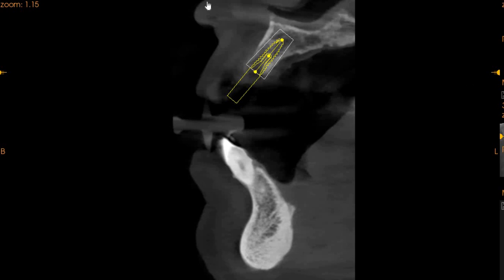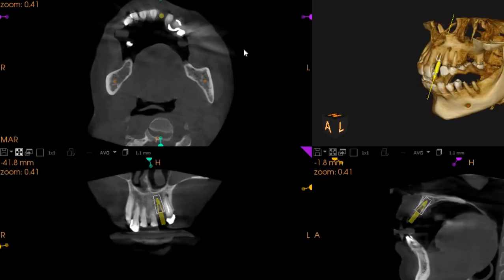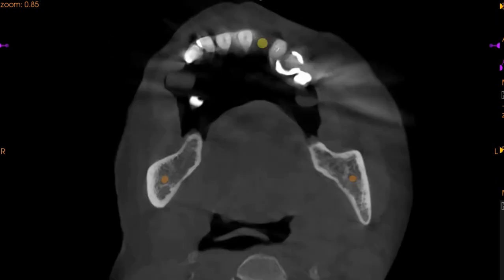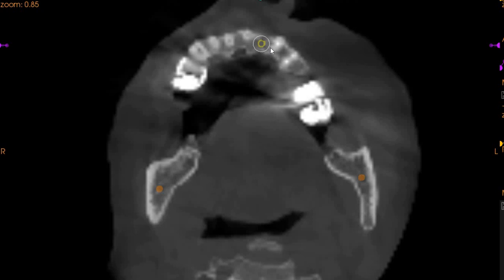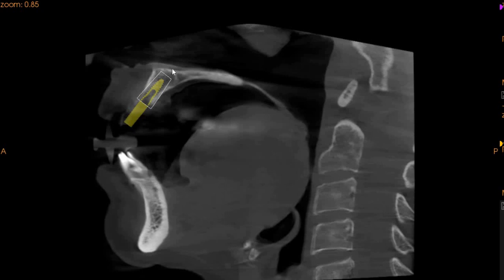We can also show you a different slice. From a coronal view, we can see that we can engage the tooth here. From an axial aspect, the implant is placed towards the palatal aspect but has good engagement areas. And this is the sagittal view of this tooth.